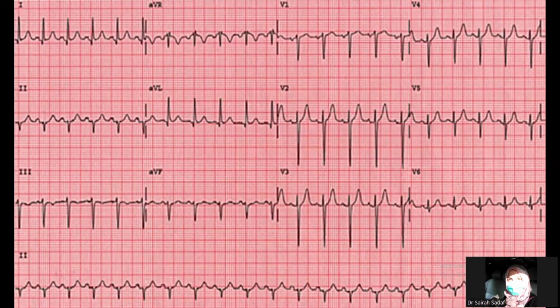Where are lead 1 and AVF in this one? This is lead 1. This is AVF. This is a pathological left axis deviation. PL is pathological left. Yes, very short for pathological left axis. Jennifer, too short. PL. All right. So this is pathological left axis deviation.